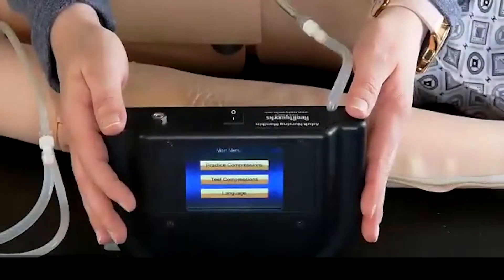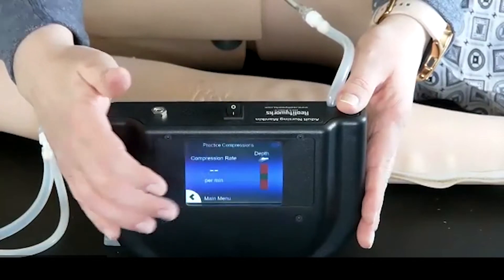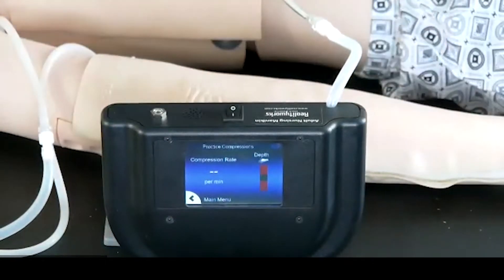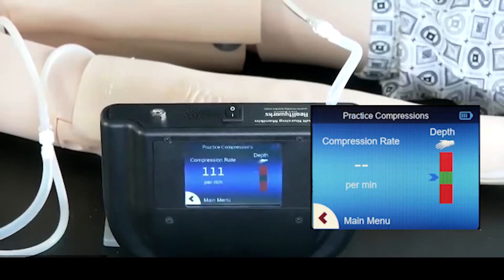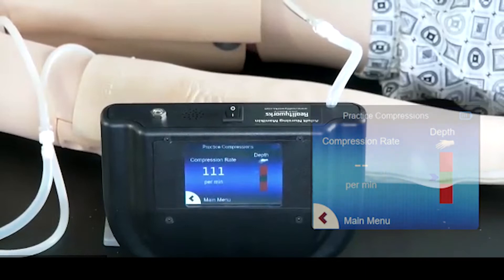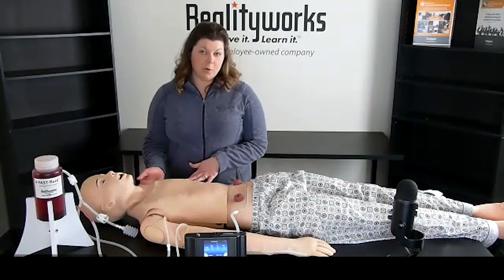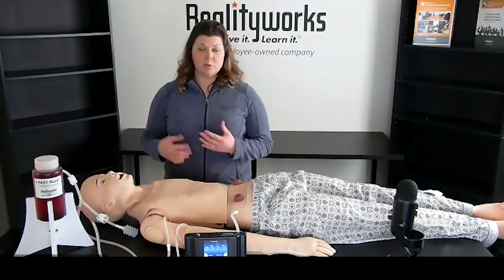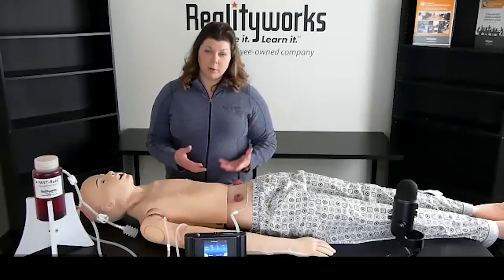So let's take a look at the controller. As you can see here there are practice and test modes. In practice mode it'll display the compression rate and the depth. Remember you want to get a compression rate of between 100 and 120, and the depth should be in the green range. Just a reminder that the mannequin measures compressions and depth but it does not measure the breathing component. So if you are doing the 30 compressions with two breaths type of CPR, please realize that the controller will only give you the compression and depth feedback.